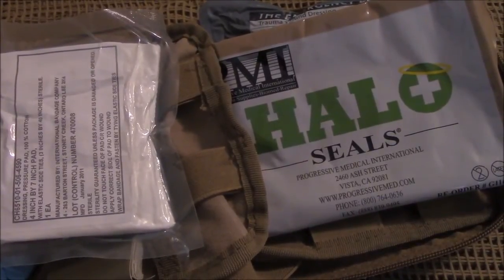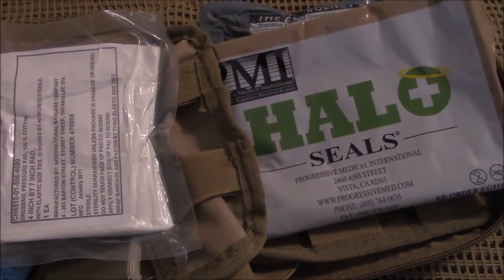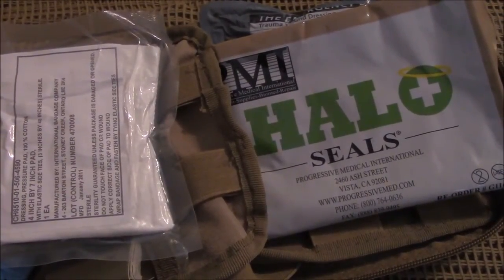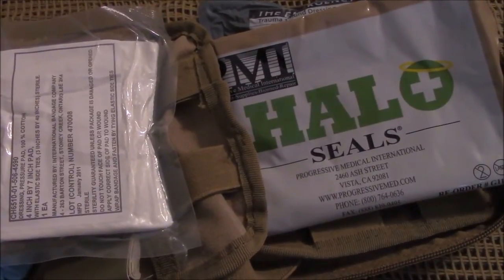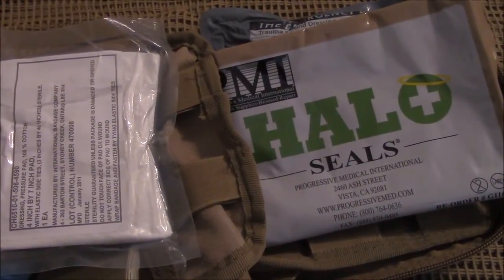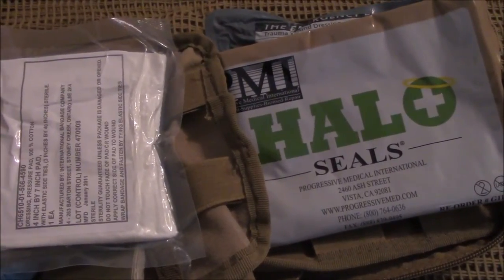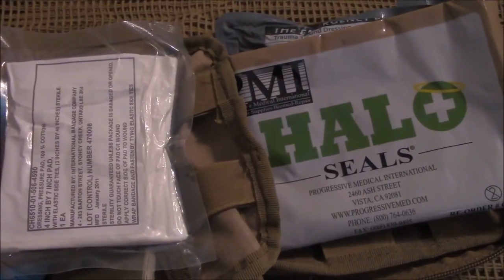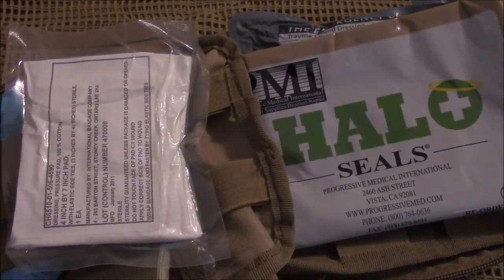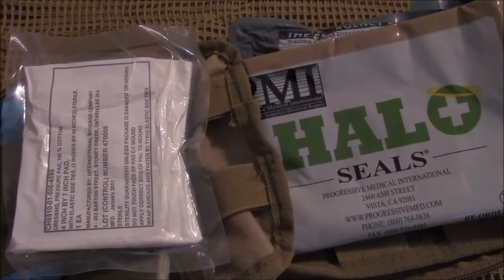I picked these particular items for specific purposes: one, I wanted the student to be able to put on a tourniquet and get by themselves, but also to make it cost effective. They can always upgrade to a CAT tourniquet or a SOF-T — something a little more sturdy — but the TK4 works and price-wise it's a lot cheaper and still effective. As students get more into emergency medicine and study what they need, they'll add to or take away from their own kits.